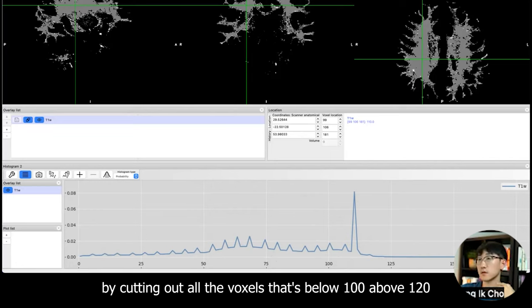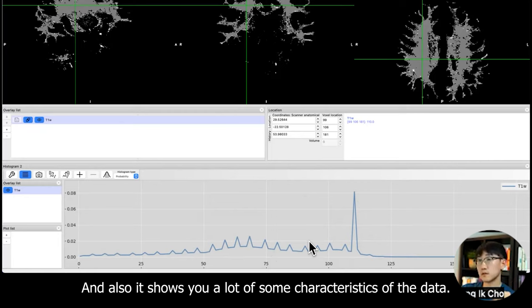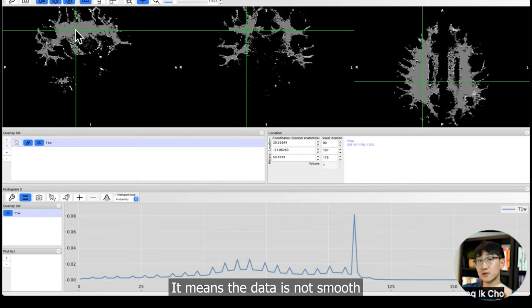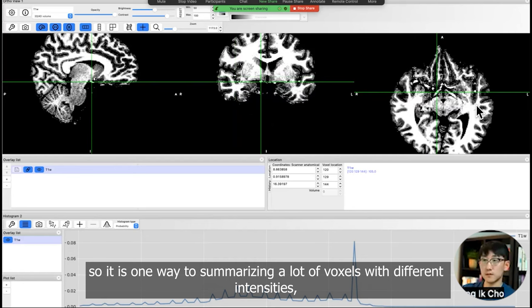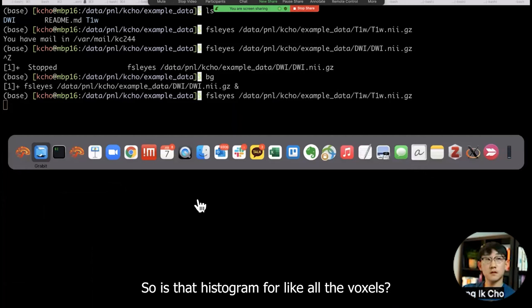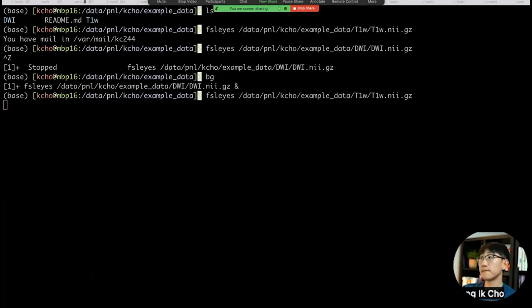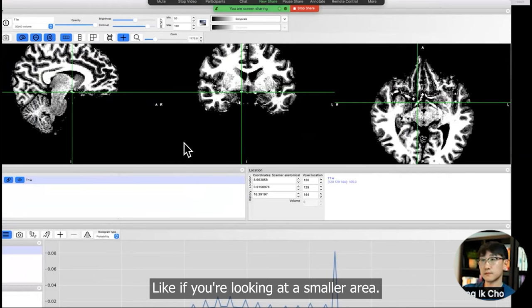And also it shows a lot of characteristics of the data. For example, here there's a little peak. It means the data is not smooth. It's one way to summarize a lot of voxels with different intensities. That's how you use them. So is the histogram for all the voxels? Yeah, all the voxels in the image.